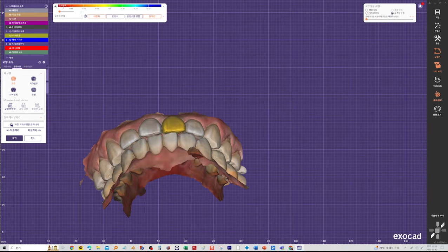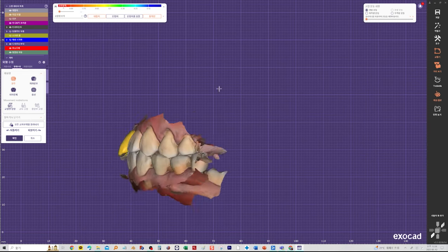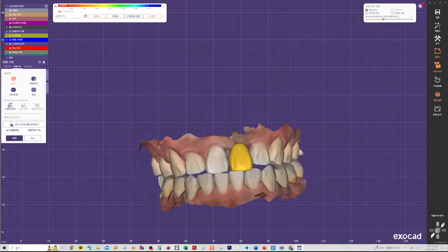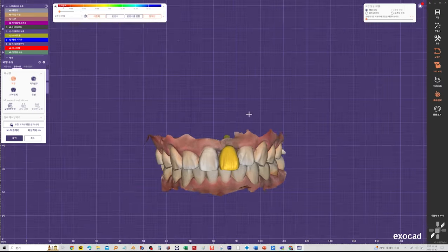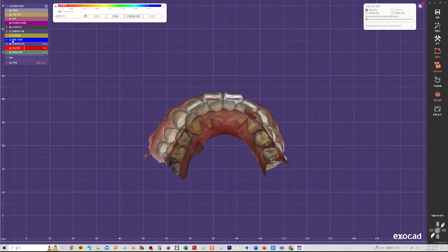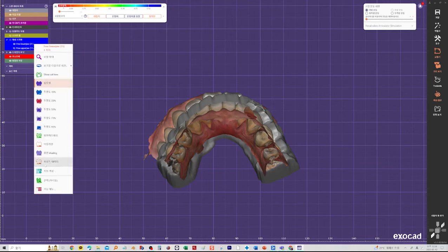Most of the time, when we fabricate a crown like this, we see a significant amount of interference with the forward movement of the mandible.